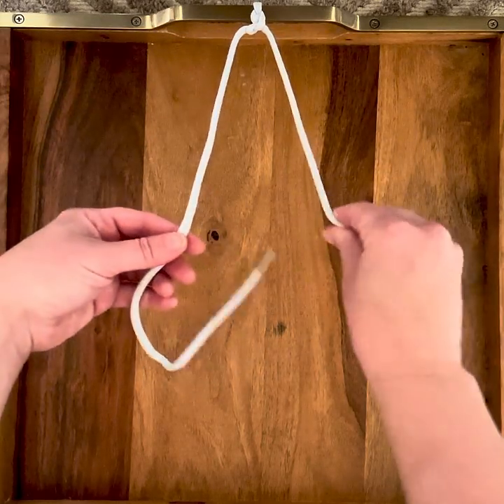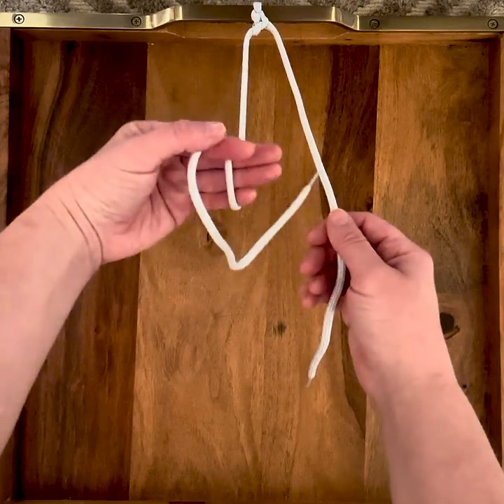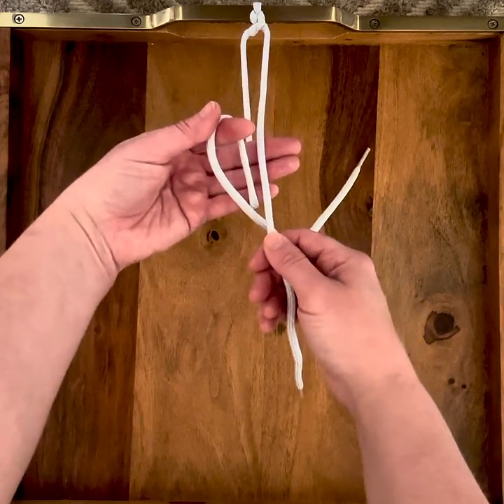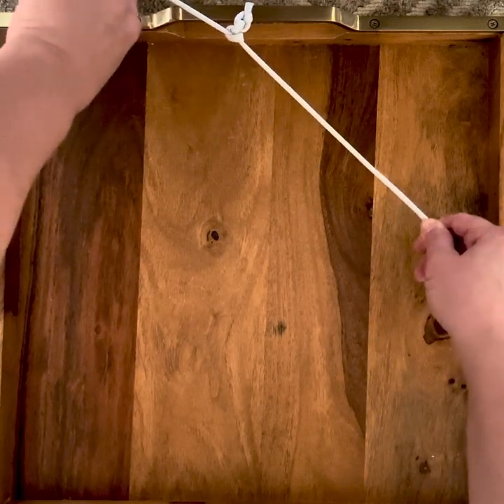On the second move, holding gently, take these three fingers, come around, flip them like this, pull through, and set your knot.